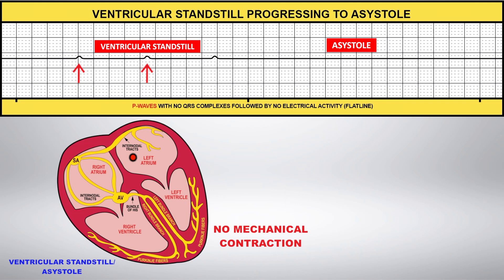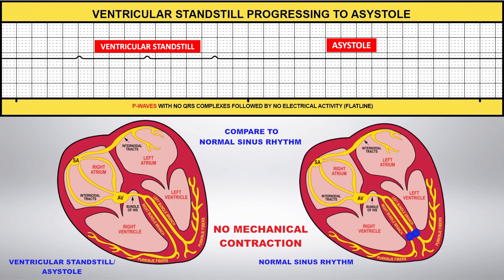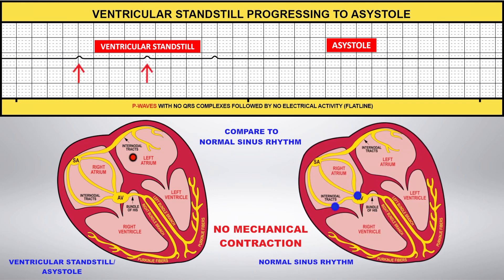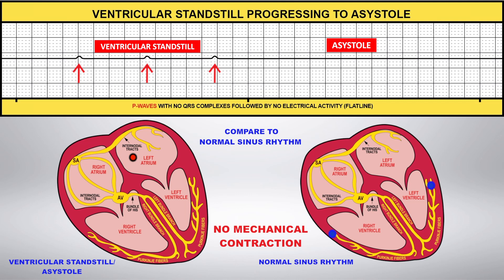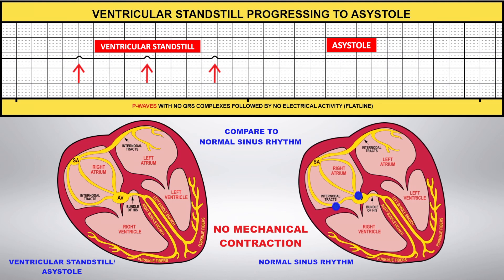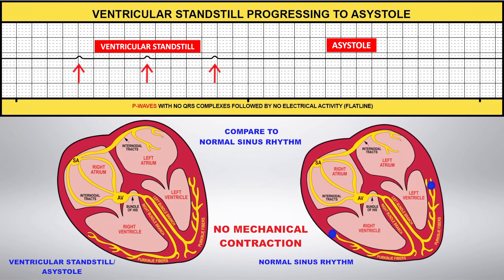Asystole occurs when there is no electrical activity in the heart in either the atrium or the ventricles, so there are no P waves or QRS complexes. Compare this to normal sinus rhythm. Asystole may appear as a slightly wavy or straight line on the EKG.